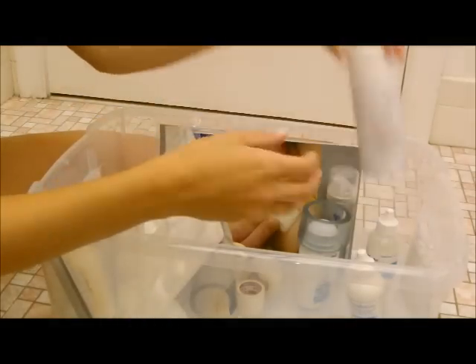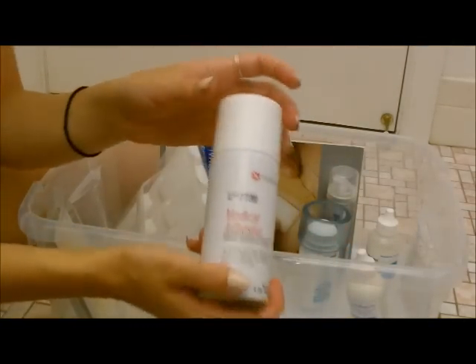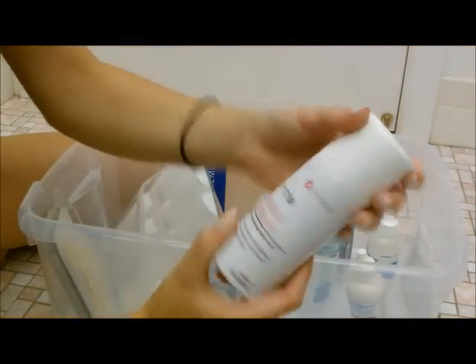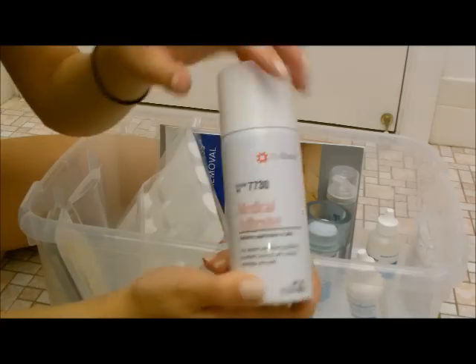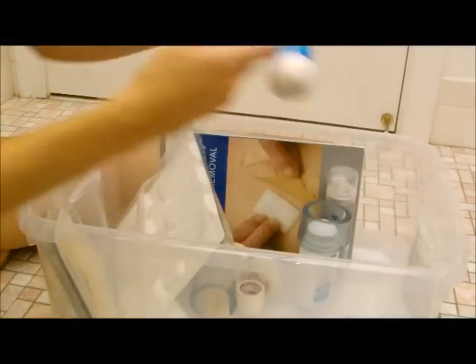I also have Hollister adhesive spray. This is supposed to help your bag or appliance stick better. I have used this. It does work. But I don't use it too often, because if I get a good bag, then I get a good bag. I don't really need the adhesive spray.